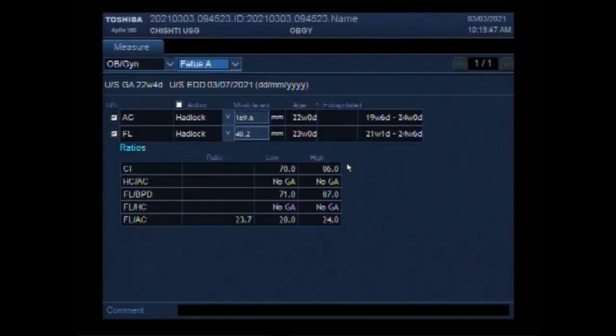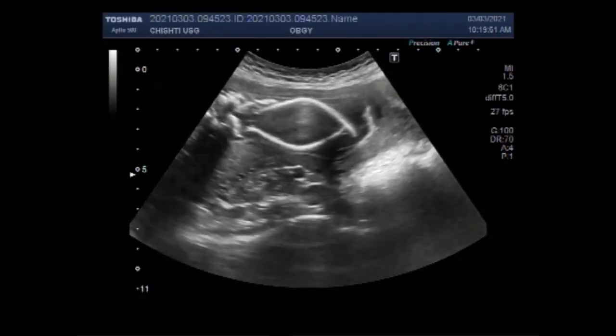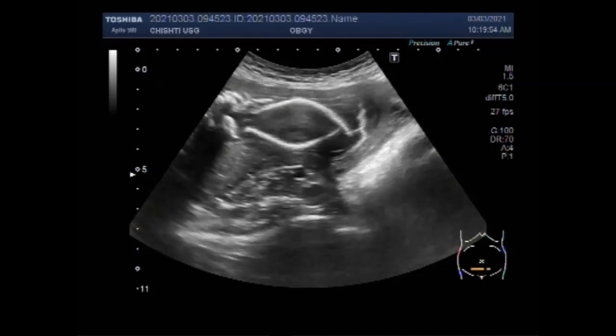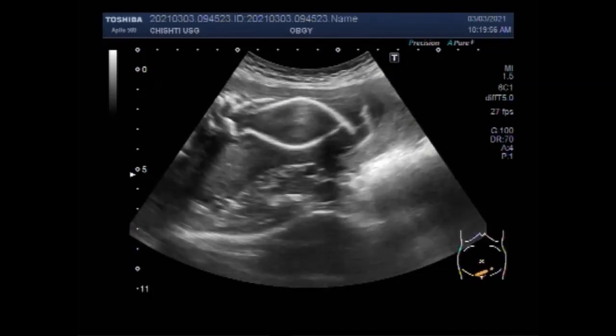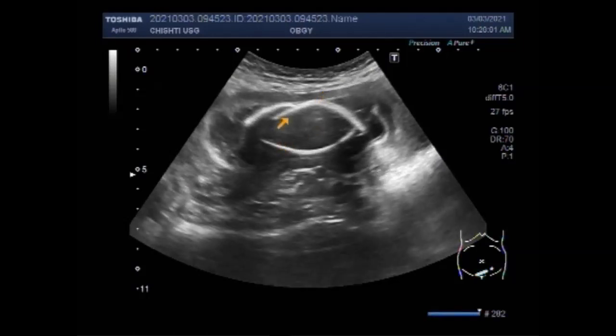This ultrasound video shows a late stillbirth with pregnancy of more than 24 completed pregnancy weeks. You can see the Spalding sign. The skull bones are overlapping on each other due to the fetal demise, and the overlapping of the skull bones shows that fetal demise is an event of late past. You can see the overlapping of the skull bones.